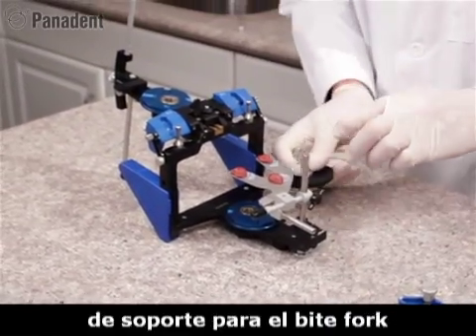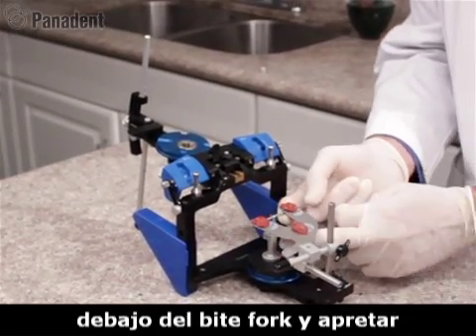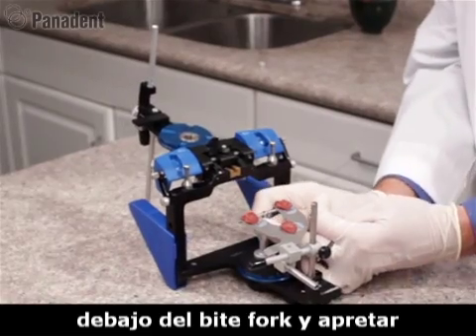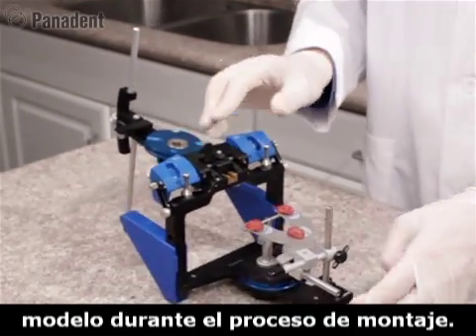We have a bifork support system which we can index to the lower magnetic plate. We raise the teeter-totter up underneath the bifork and tighten it in place with the screw, creating a solid support for the cast during the mounting procedure.